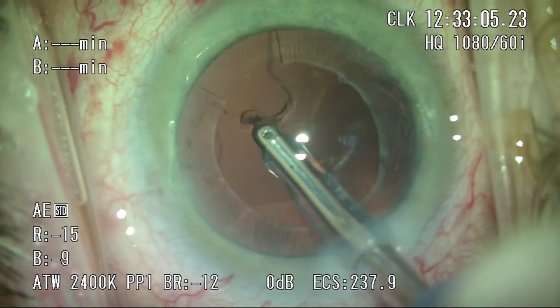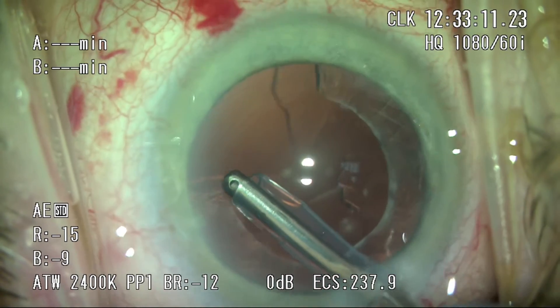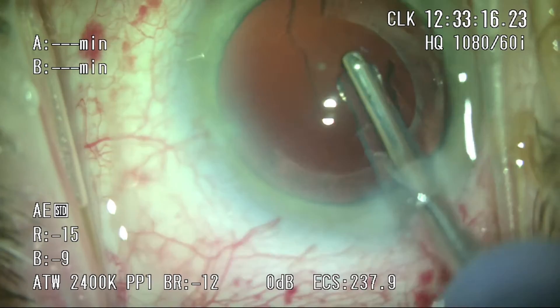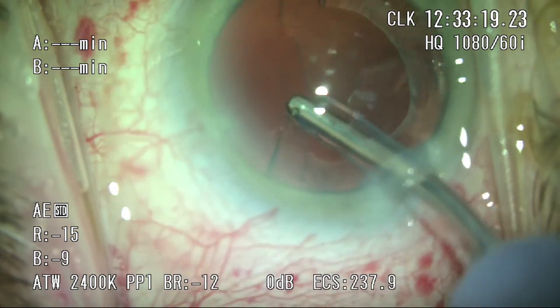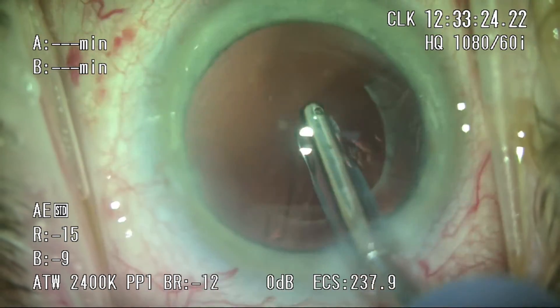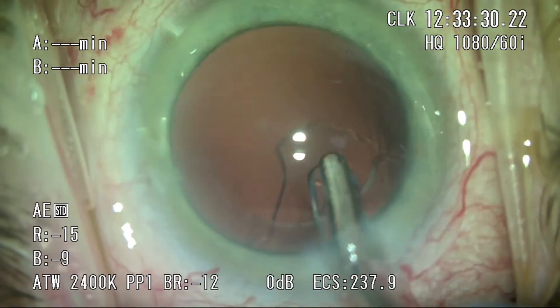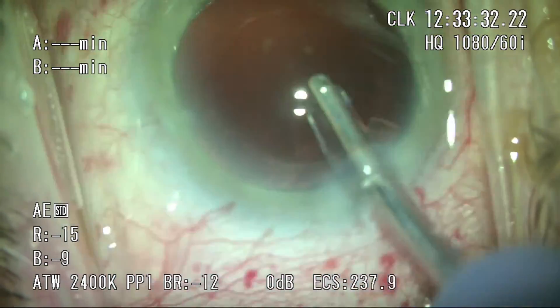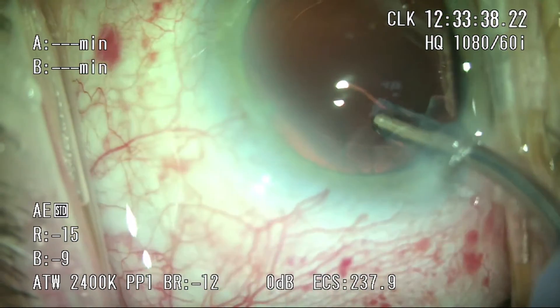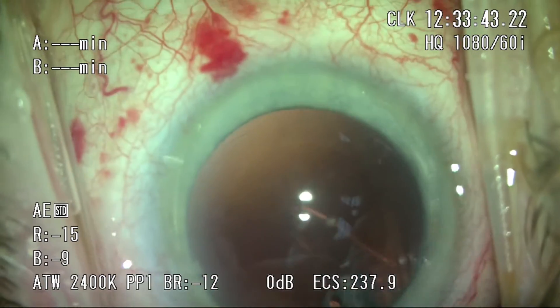A quick word on microincisional cataract surgery: during irrigation and aspiration, the sleeve on the IA tip completely obstructs and seals the corneal wound. As a result, there's very little to no fluid egress, resulting in tremendous anterior chamber stability, which really allows us to go after subincisional cortex much more easily. Particularly in femto-assisted cataract surgery where subincisional cortex is more difficult to get, this provides a real advantage. That said, in about 30% of cases we do need bimanual irrigation-aspiration for the subincisional cortex.